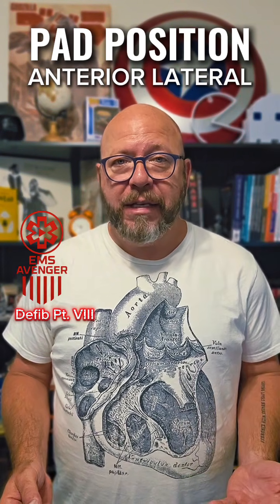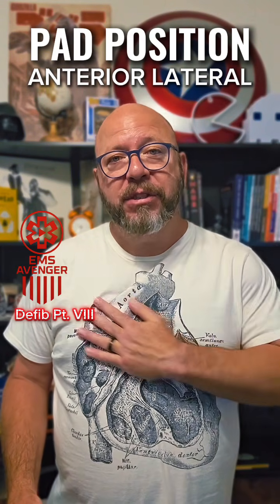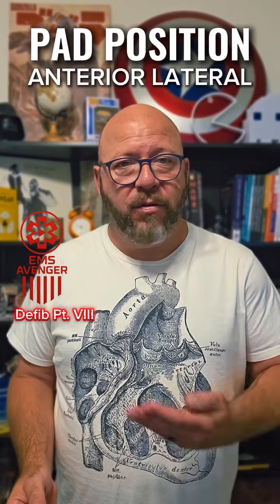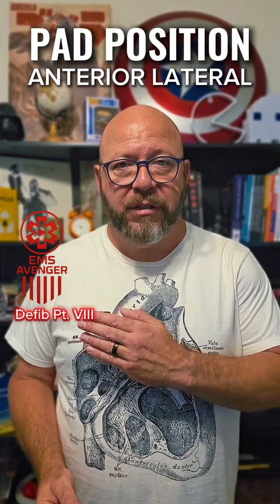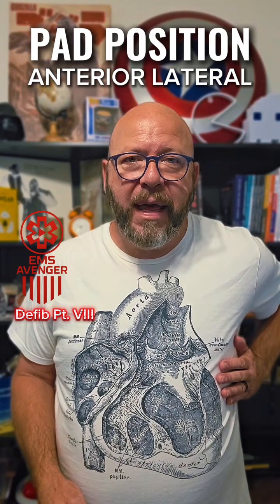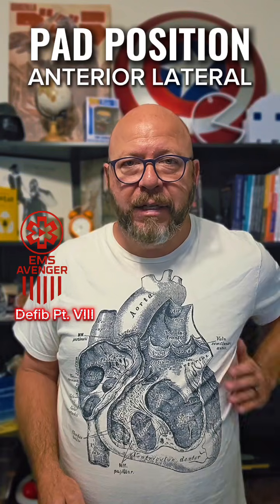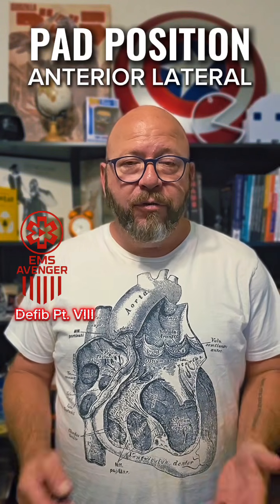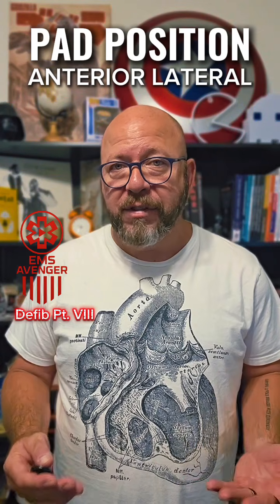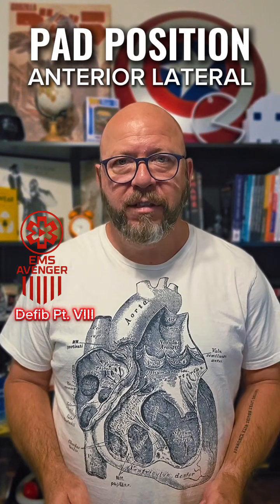And when we visualize that vector, we want to see it crossing over and through as much of the left ventricle as possible. And so when you're visualizing that vector, if it's not crossing over and through as much of the left ventricle as possible, maybe it's too high, or maybe it's too low, or maybe this apical pad isn't where it's supposed to be, maybe it needs to be moved towards the mid-axillary line, then you need to fix that, preferably before your rhythm check, but it's okay to keep compressions going for a few seconds to fix it. We want that defibrillation attempt to be a perfect defibrillation attempt.